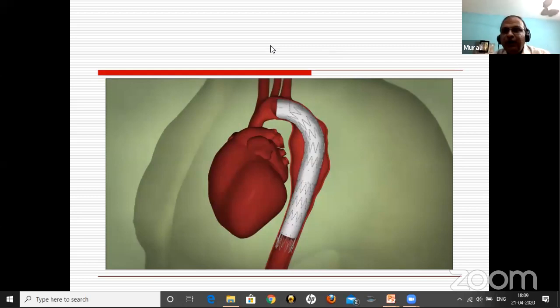I don't think so. You have to land the graft where the graft has to align nicely with the alignment of the blood vessel. If there is a kink, don't land in the kink. Come to the straight portion and land the distal end of the graft. That's all. So that you have to look at the long-term outcome. You don't put in a curve. You come in the straight portion and deploy the graft. That's what I mean.